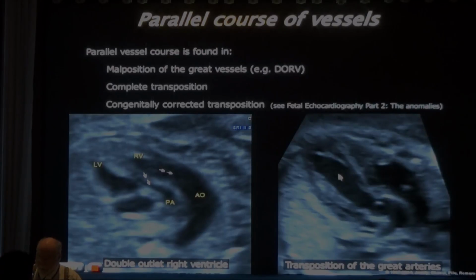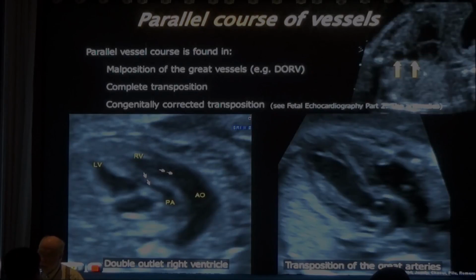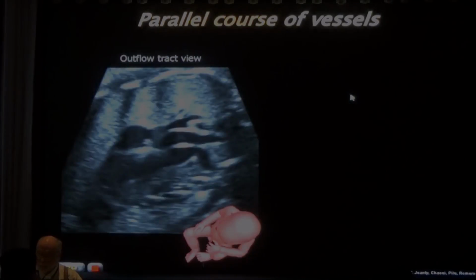Here we have the left ventricle going to a vessel, and that vessel is dividing very rapidly. Typically, the length of this pulmonary is only about 2 or 3 times its diameter, so that complicates the repair of those transposition of the great arteries. And when you make a cross section at the level where you have the aorta and the pulmonary, you see the two vessels side by side, something you cannot get in a normal fetus.